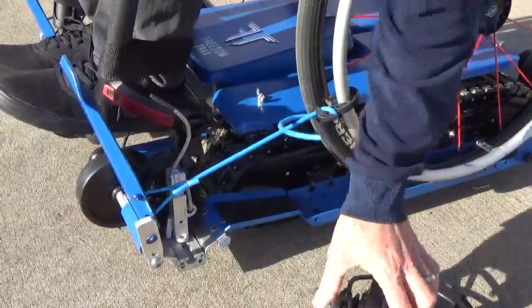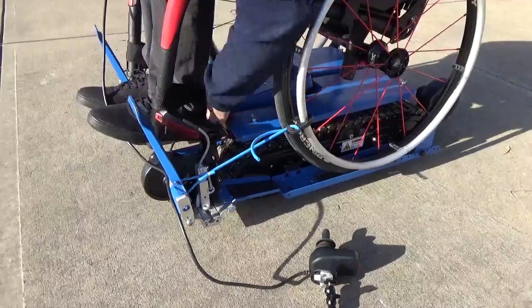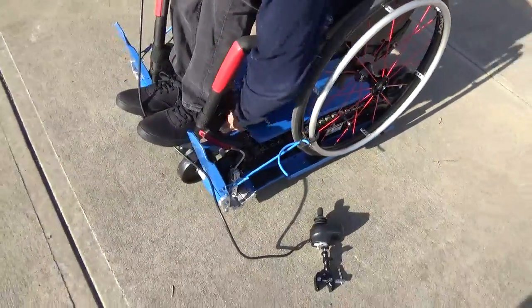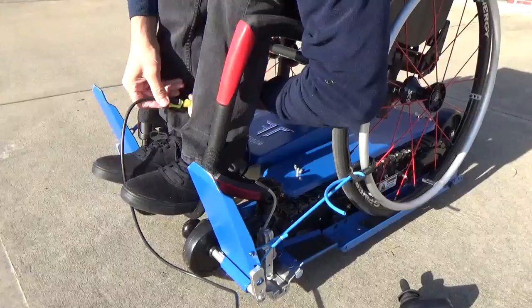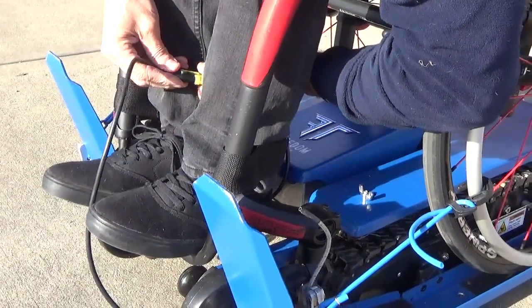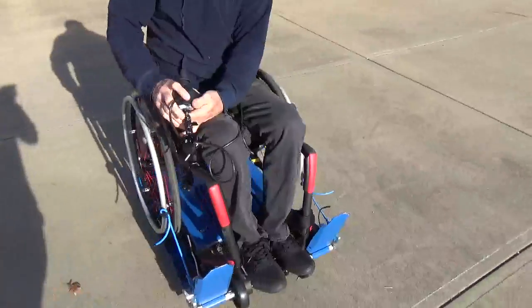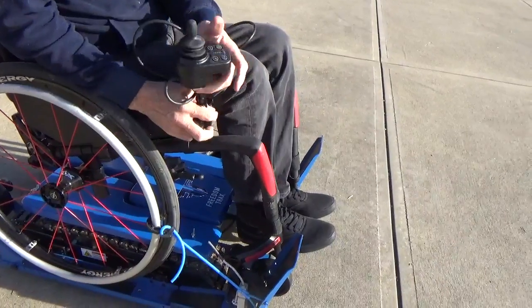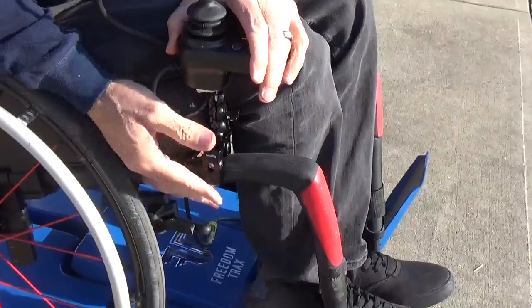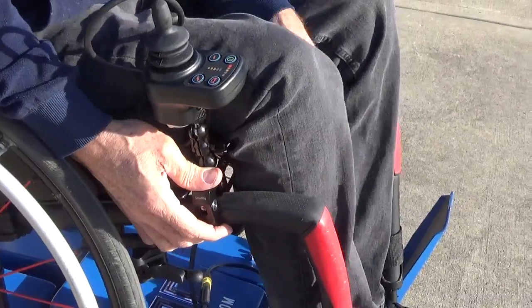Now that everything is in, the chair is mounted good. I'll take my remote control, reach through here, and find the wire that it connects to. Pull the wire up and make the connection. Now that I'm connected, I'll come over to my other side. This remote has a clamp here that allows me to clamp it to my chair, so I can clamp it on right here and tighten it down. Now that it's tight, the remote sits there like any normal power chair remote does.